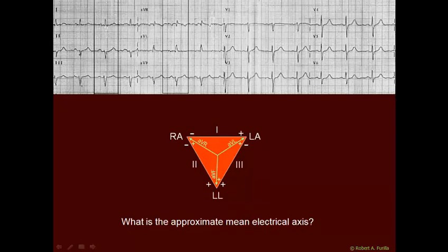We've seen this EKG in the 3-lead discussion, and I'm going to use it again, only now I'm going to take advantage of these augmented leads. So let's look for an isoelectric or biphasic lead. Well, this is not it. It's upwardly deflected. That's downwardly deflected. Again, that's downwardly deflected. Over here we see a downward, upward, and right here what we see is something that is very close to isoelectric. So I'm going to call that our isoelectric lead right there.